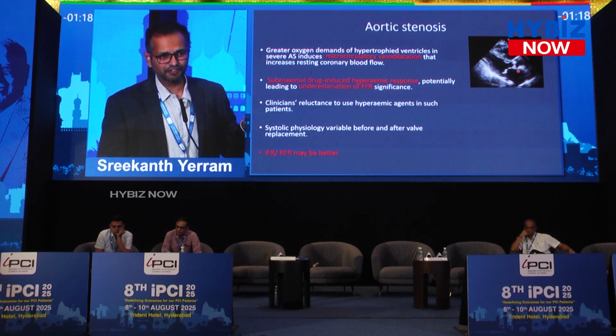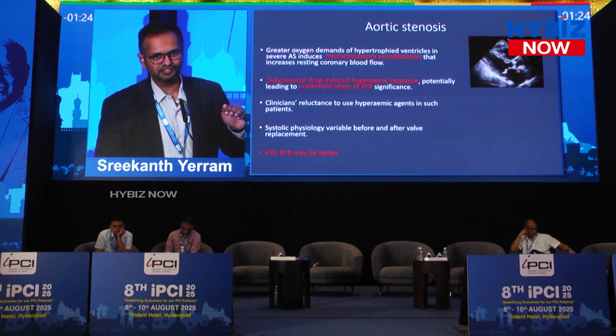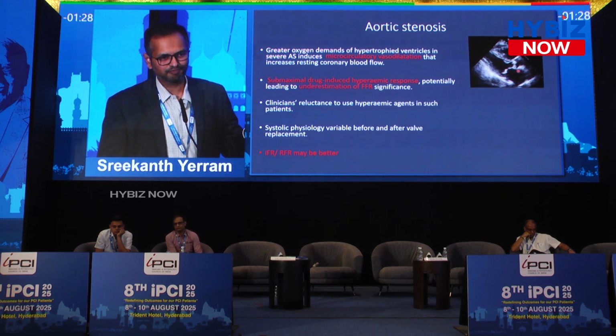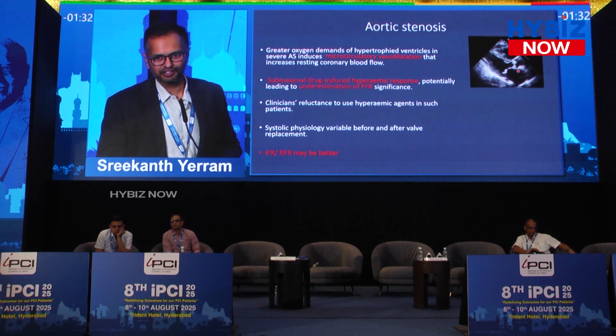Is IFR, RFR better than FFR in this subset? Yes. Why? Because in aortic stenosis, your resting microcirculatory resistance is lower. So the effect of adenosine is less in patients with aortic stenosis. So your RFR, IFR is way better than FFR in this subset.